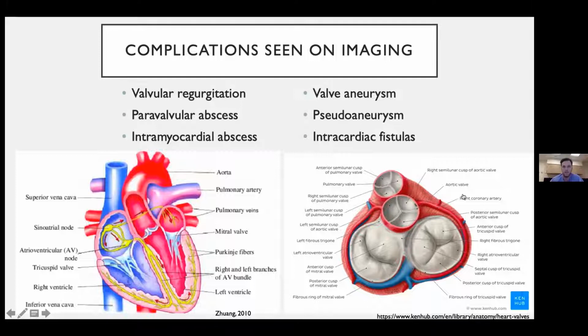And keep in mind the location of the chambers and vessels relative to each other because fistulizing connections can occur. Also, again, remember that complications can develop over time. So if initial imaging doesn't show a complication, but the patient's status changes or clinical suspicion remains high, you may need to repeat imaging or use an alternate modality.